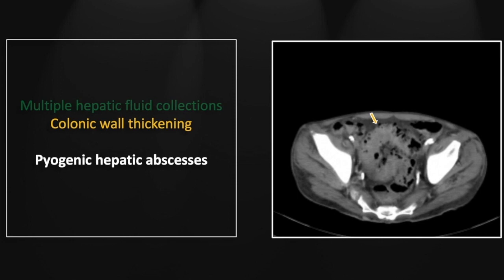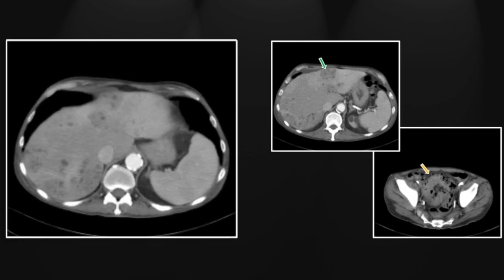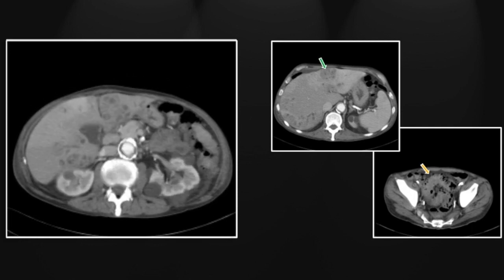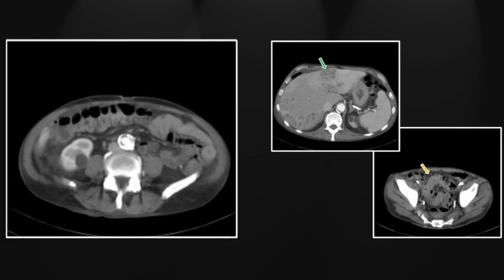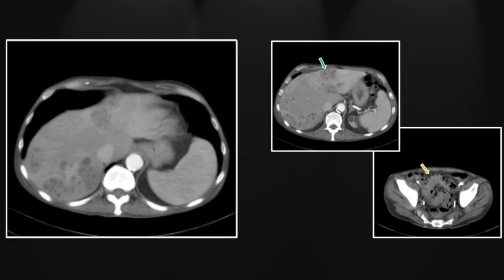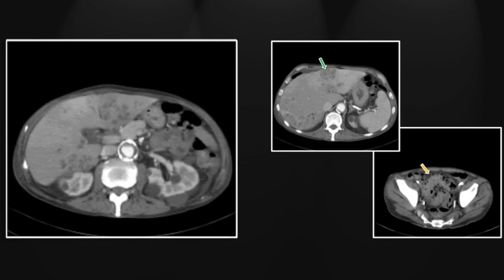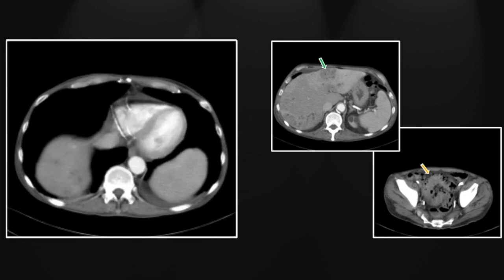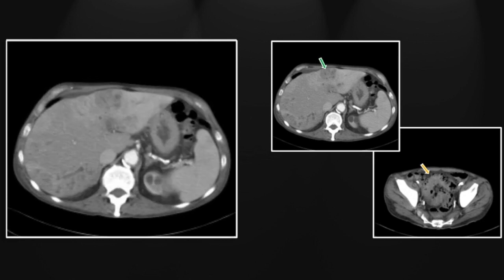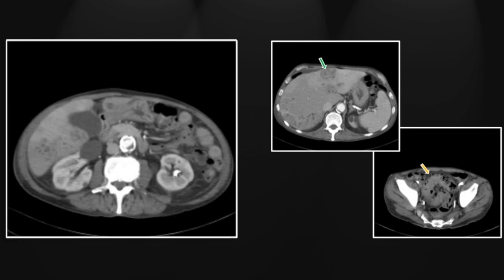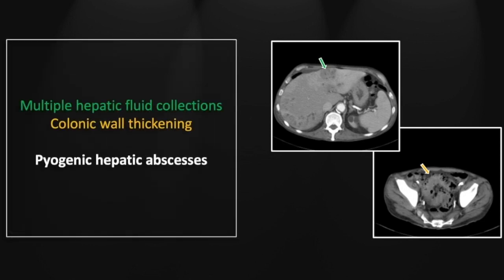Colonic wall thickening is present here as well — not as much stranding as on the prior case, but the ultimate causative agent being E. coli certainly points to the colon as the source. Note again not only the hypodense fluid collections within the liver, but hypodense filling defects within the portal vein and the marked perfusion changes present throughout the liver. That is a case of pyogenic hepatic abscesses related to septic thrombophlebitis of the portal vein.